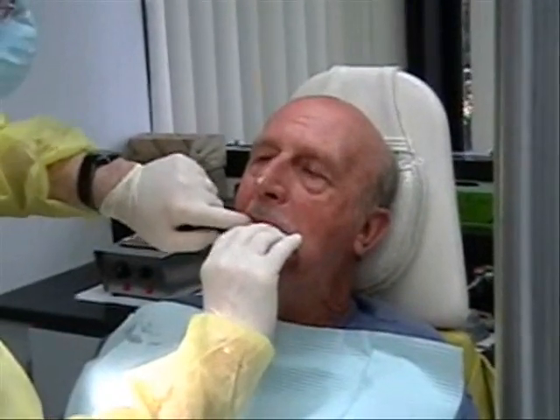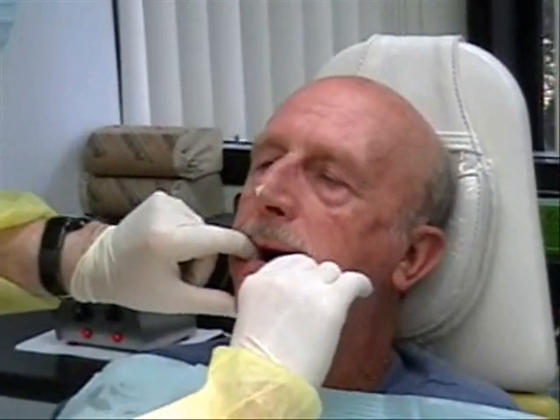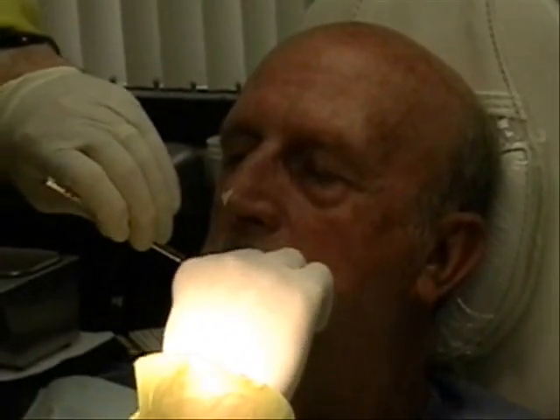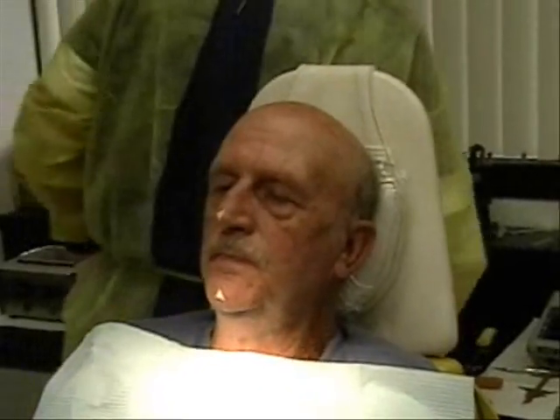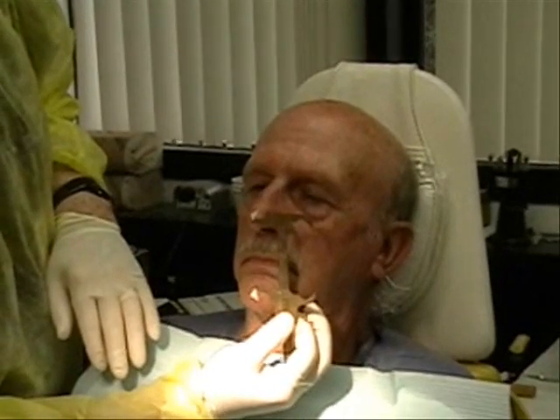I'll go back in. Just relax — when you try to help me, your lip gets tighter. Close down. See how far off we are. He's still strained and we're closing in. Open just a little bit — I've got to get over that ridge and then slice that down. Go ahead and close again, just relax. We're getting a little better. I think you're just a tad off right now. It looks a lot better. Pretty close.